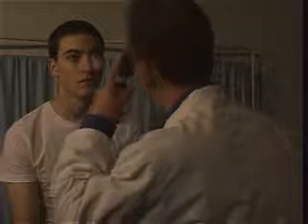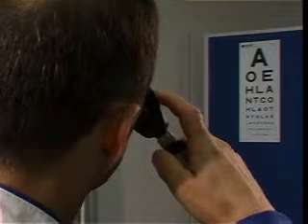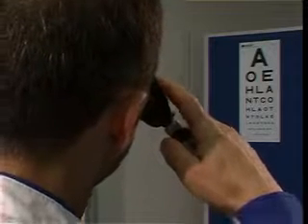Ensure that both you and the patient are in a comfortable position with your eyes at the same level and at about 1 meter away from each other. Ask the patient to remove their spectacles. Contact lenses do not need to be removed unless they are tinted. You can keep your own spectacles on or remove them as required. If you do remove your own spectacles, you will need to compensate for this by changing the diopters accordingly.